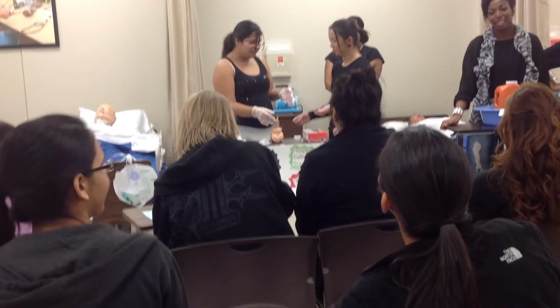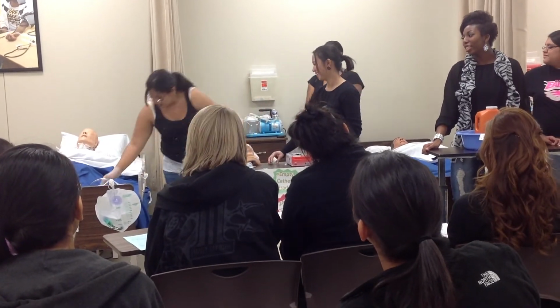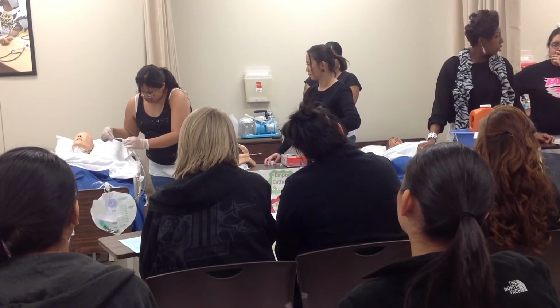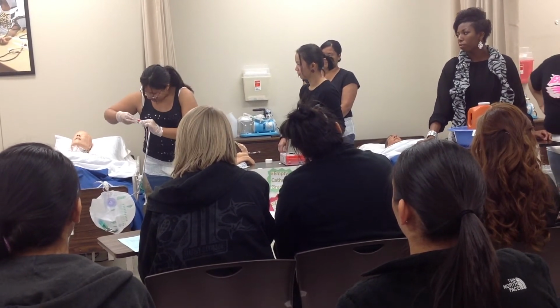Okay, so you're gonna want to go ahead and connect it here. You have to take the tape off.